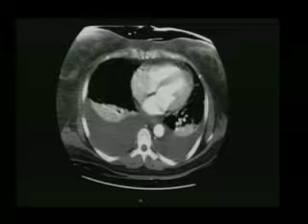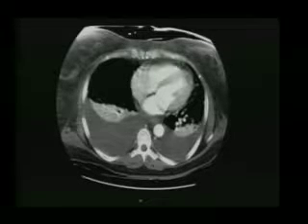If your hypogastrics are already occluded, then the risk of paraplegia is high. Or if you already have an infrarenal abdominal aortic aneurysm repair done, because intercostal or lumbar vessels are already covered, the risk of paraplegia in those cases goes high. So you have to be very careful. If the left vertebral artery is dominant and you're planning to cover the subclavian, then you do a carotid subclavian bypass and then do the TEVAR.